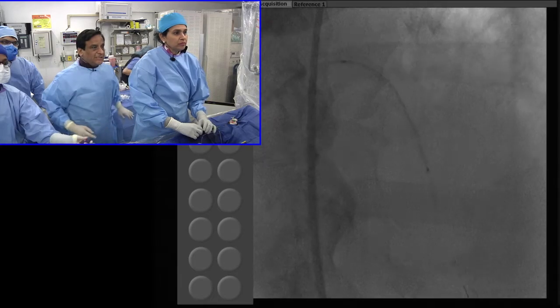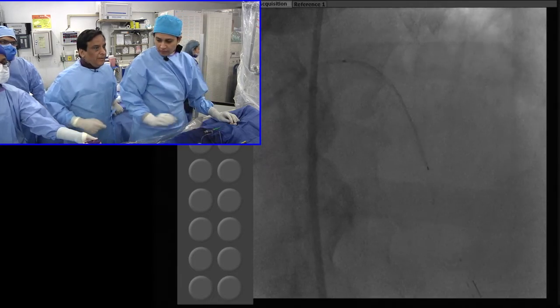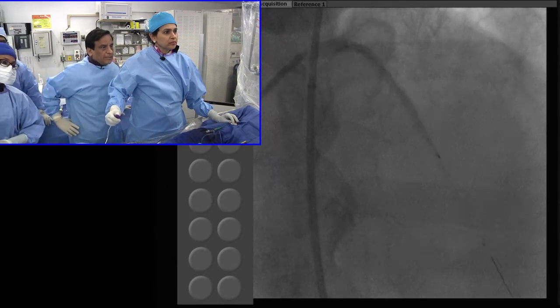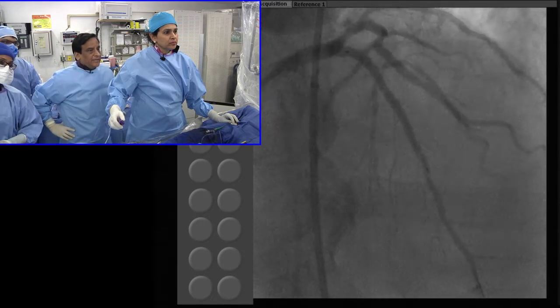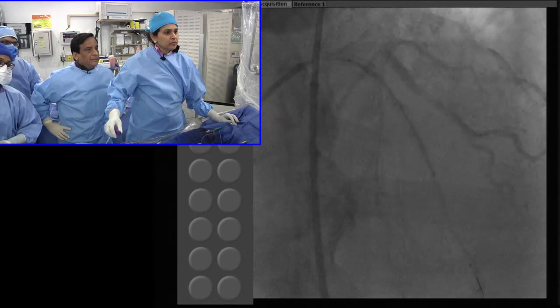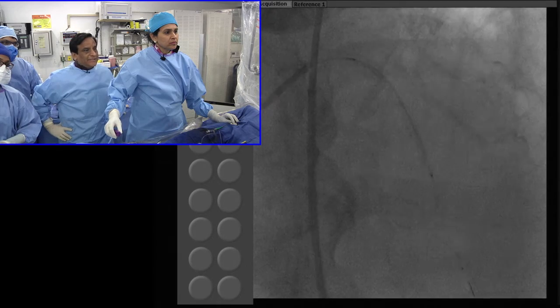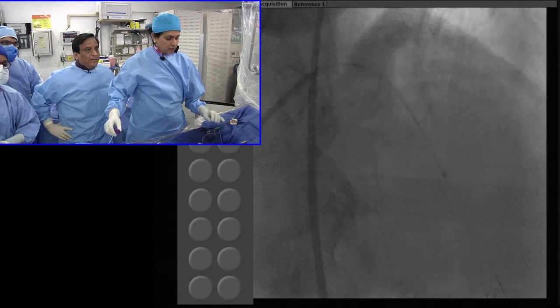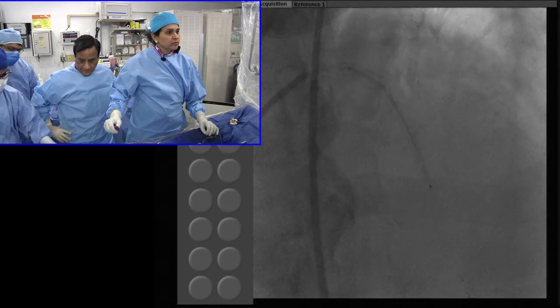We will be able to see the distal segment. We can see if there is dissection or anything. If there is dissection distally, we will definitely put a stent distally also.